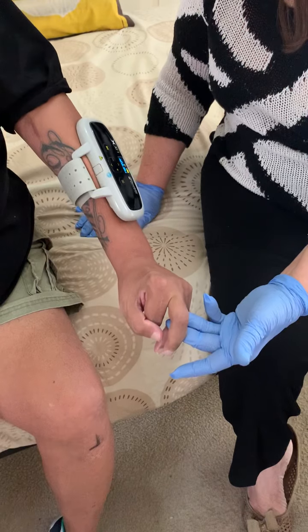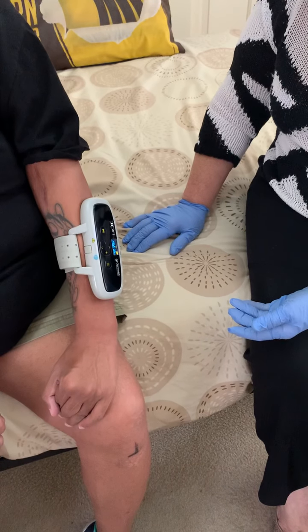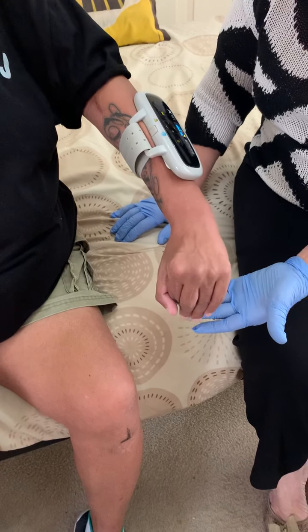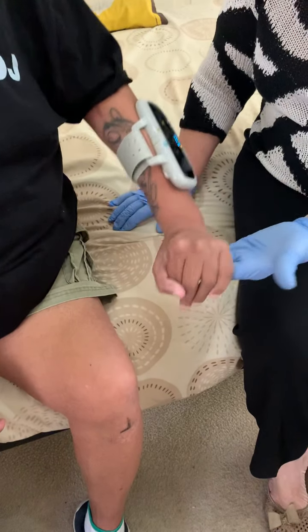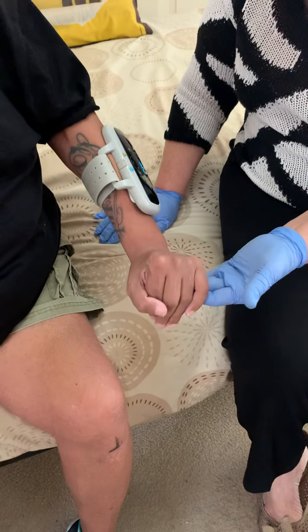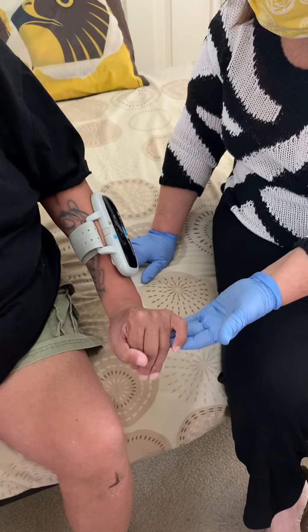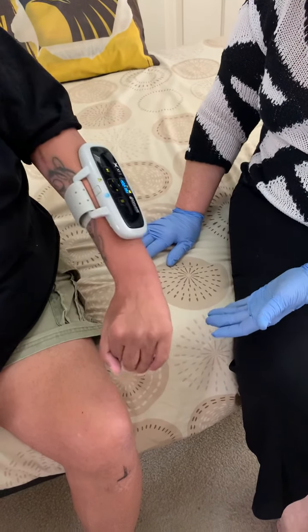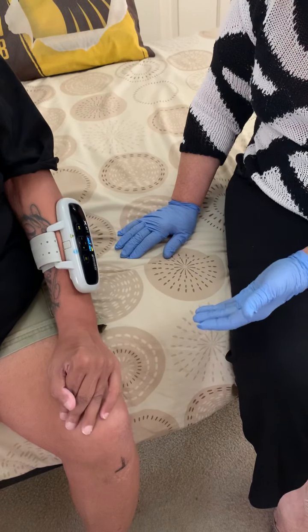I'm going to lift my hand up, relax and put it back down on my leg. Relax slowly, come back up. Open my hand. You're moving it. In time my grip will get stronger, but you've got to keep practicing — about 500 to 600,000 repetitions for new neuro brain waves to come back. But this has only been around since November and I got it yesterday for the first time. What an amazing piece of equipment.